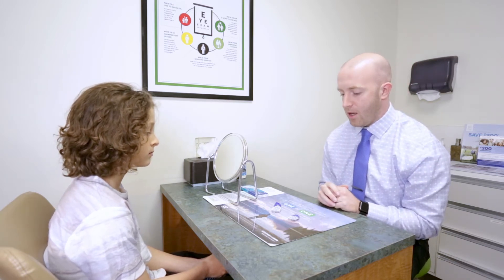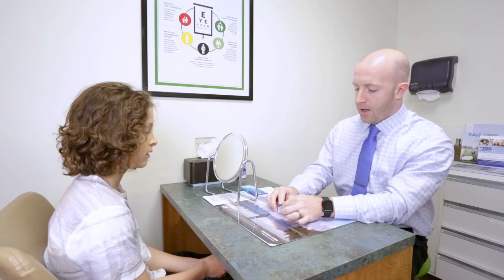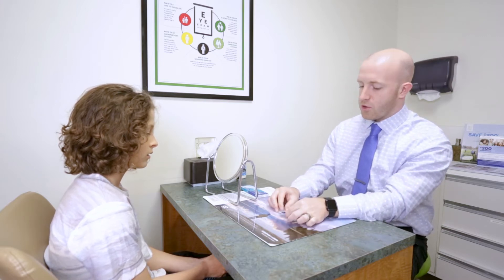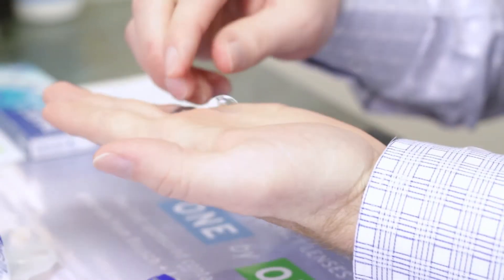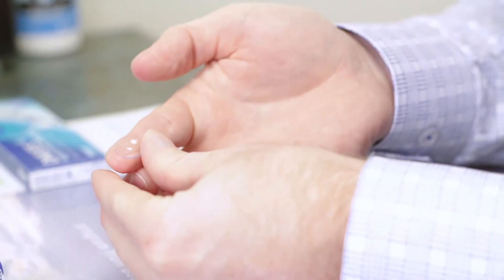We both did that already, which is excellent. I opened up one of your contacts already. What you're gonna do is take the contact either out of your case, or with these daily lenses, right out of the little trial pack, and put it right on your finger. If you're right-handed, put it on that right index finger. Look at the contact and make sure the edges are straight up — no imperfections, tears, rips, or dust.